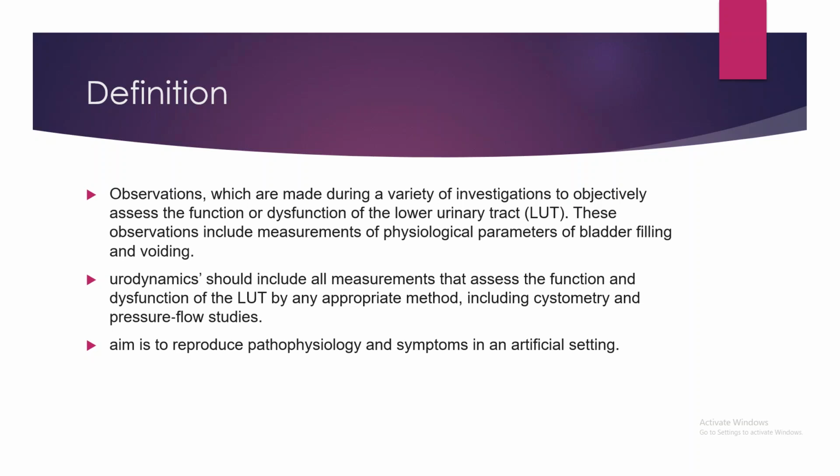And what is the aim of urodynamics? It is to reproduce the pathophysiology and symptoms in an artificial setting. It's not that you are going to do this urodynamics the whole day. It is for some period of time, but it is going to reproduce the symptoms in an artificial clinical setting.